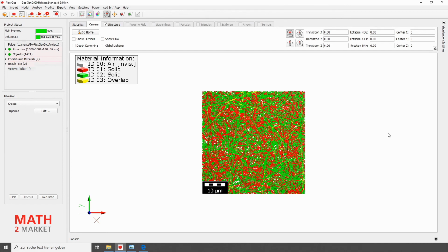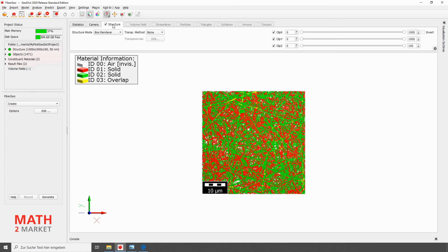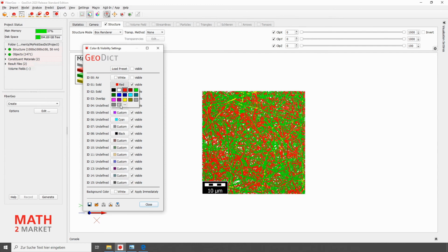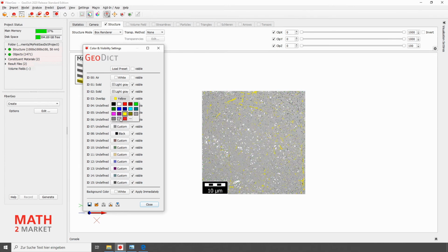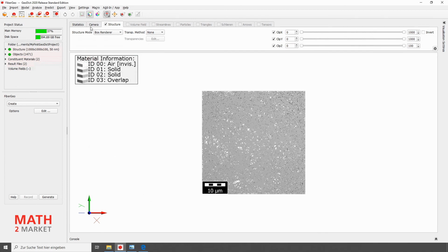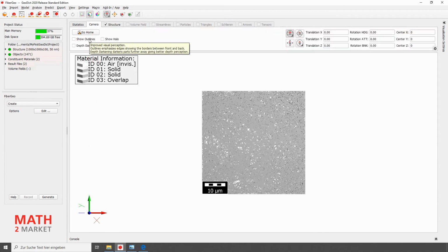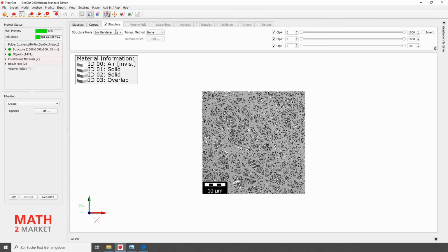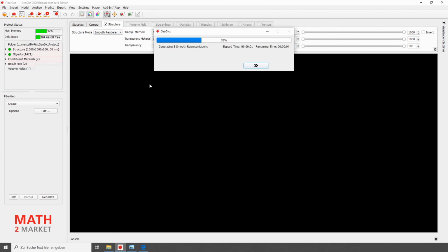In order to compare our generated fiber structure with the SEM image even better, we adjust the visualization to the SEM image. To do so, we click on the Structure tab and then on the button for the color and visibility settings, and color the fibers under ID1, ID2 and ID3 in gray. Then we click on the Camera tab and activate some post-processing effects that allow us to see more details like Show Outlines and Show Halo. Under the tab Structure, we can switch from the box renderer to the smooth renderer in structure mode. This allows an even higher contrast through the surface shaders, which allows us to see more fiber details.